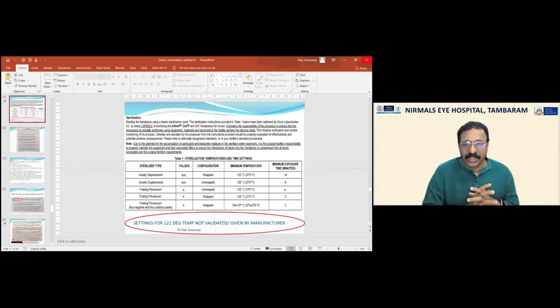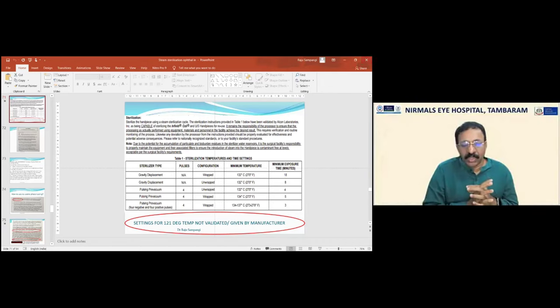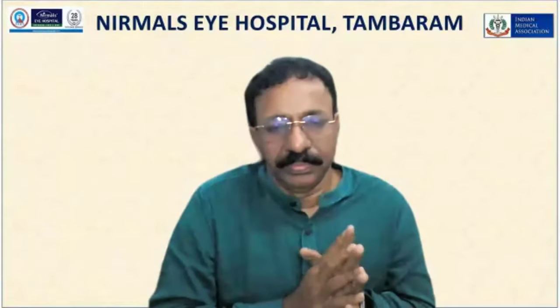When handpieces get faulty, they said that we can't have this AMC or CMC on hold because your staff didn't follow the manufacturer guidelines. So better to ask them for an official copy of that. Yeah. So during installation, we have to get their inputs in writing that this is the standard setting for sterilization. Correct.